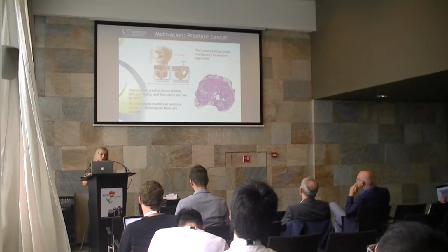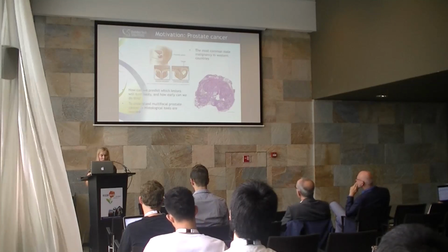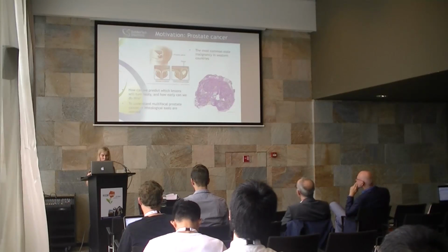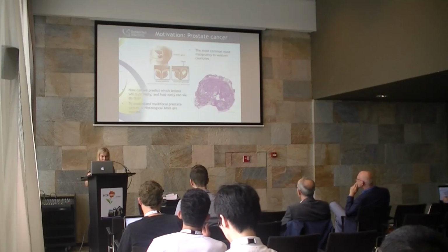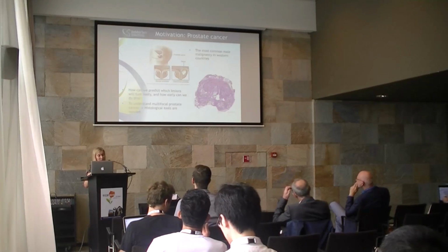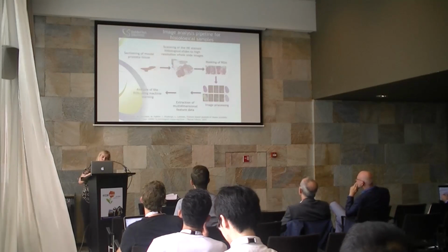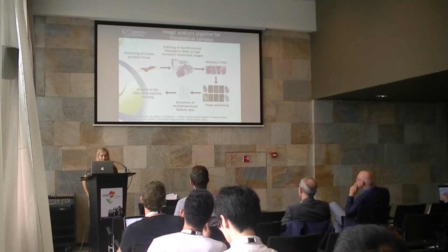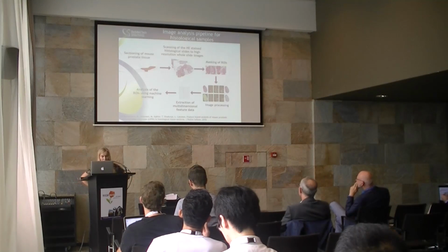So to understand this multifocal prostate cancer, we developed some histological tools to analyze these histology images and studied early neoplastic changes in mouse prostate. So we developed this image analysis pipeline for histological samples.